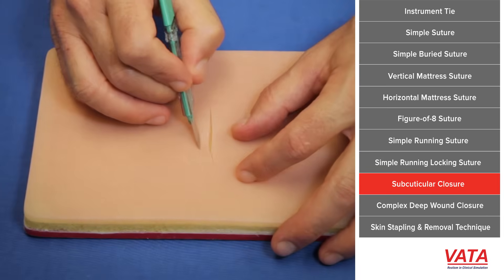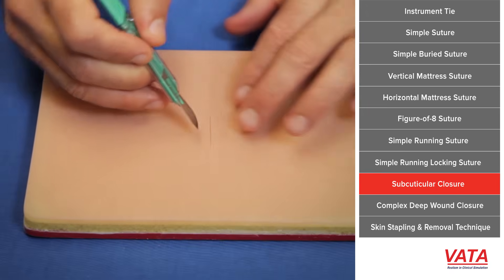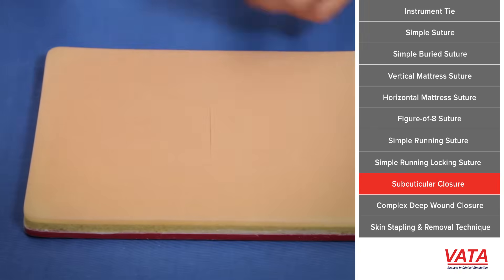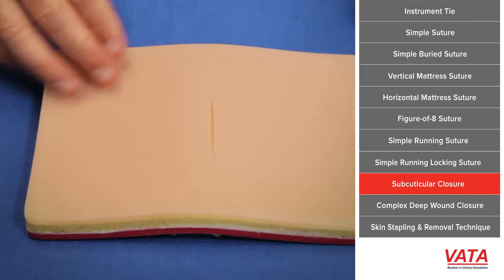Now we're getting to the fancier closures. The subcuticular closure is really what I would call a cosmetic closure. The idea here is to close the skin and not have any suture visible in the wound at all. We'll go ahead and apply the Vada device to the pad so it spreads it apart and gives us a little bit of spread.